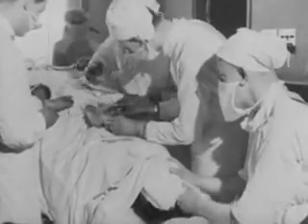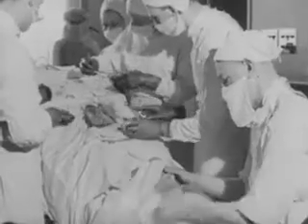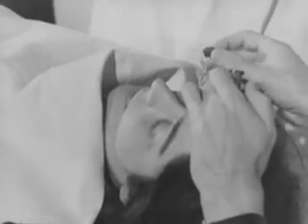At the end of the operation, put a drop or two of liquid paraffin or castor oil into each eye. But don't do it before the anesthetic, because ether vapor will dissolve in the oil, and this again may cause conjunctivitis.